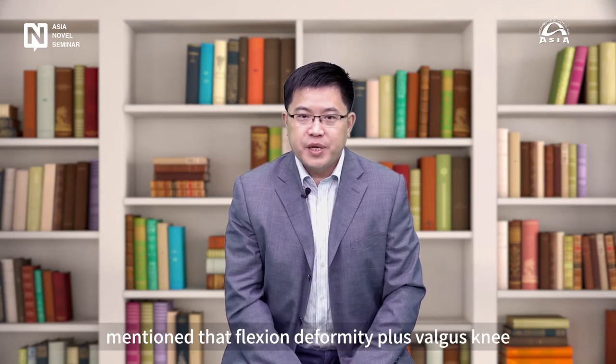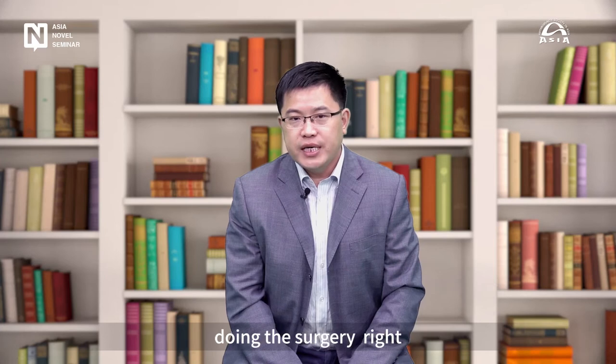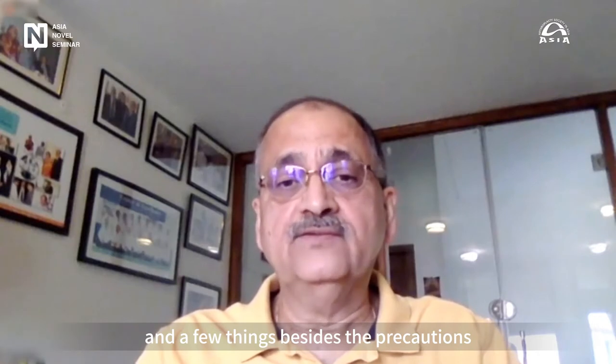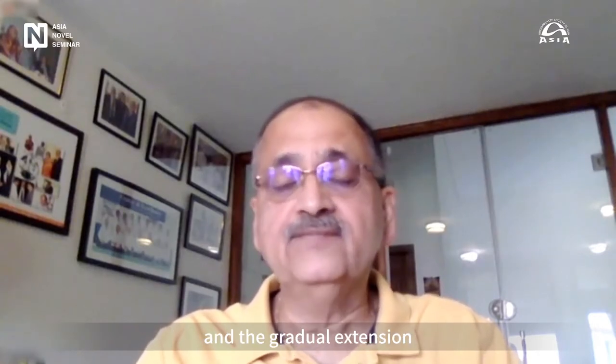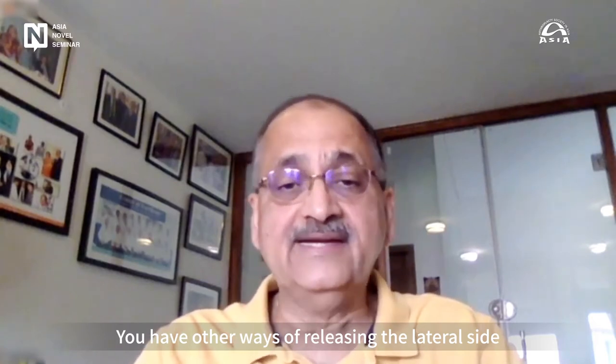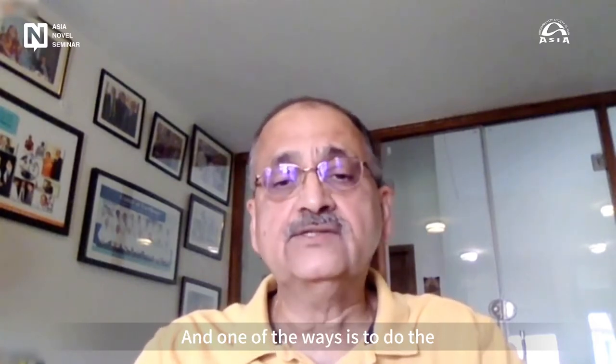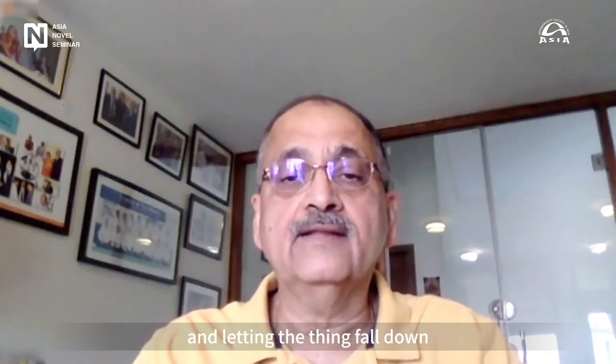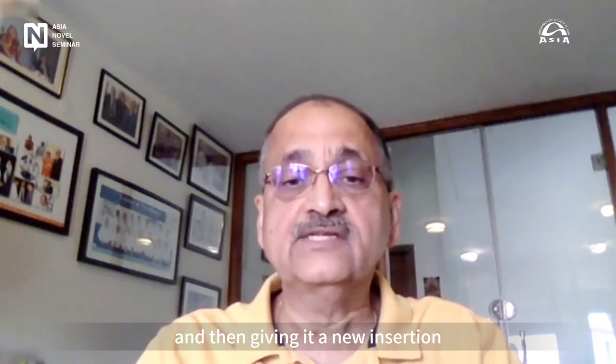I think just now Dr. Maya has mentioned that flexion deformity plus valgus knee will be very challenging for peroneal nerve injury protection. And I think Dr. Maya has experience about how to protect the peroneal nerve during the surgery, right? Yes, we have spoken, and besides the precautions and the gradual extension, you have other ways of releasing the lateral side. And one of the ways, as we've been speaking of Professor Briard here, is the lateral epicondylar osteotomy, letting the thing fall down and then giving it a new insertion.